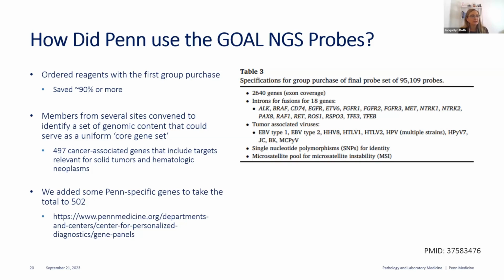So if we wanted to translate that into your community, let's say if everyone were to come up with an immune receptor test, it may be something along the lines of everybody is to offer T cell receptor gamma, IgH, and Ig kappa, right? Those are the basics that everybody is going to offer on their test. And any type of add-ons you want to do, that's on you to do individually.